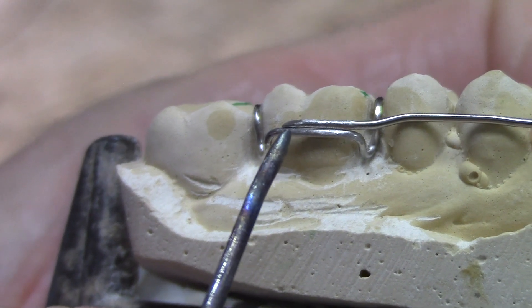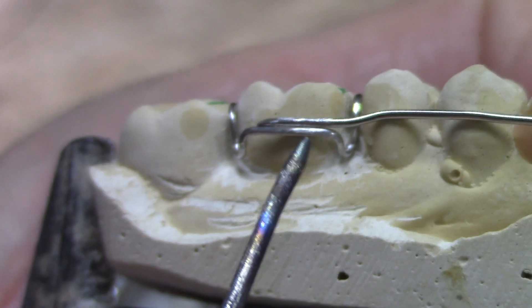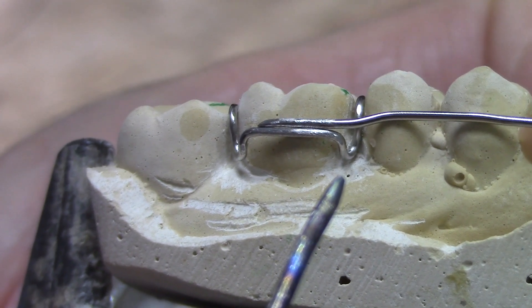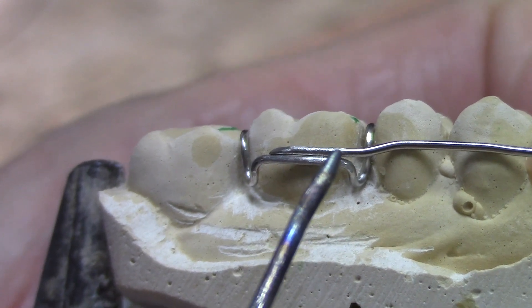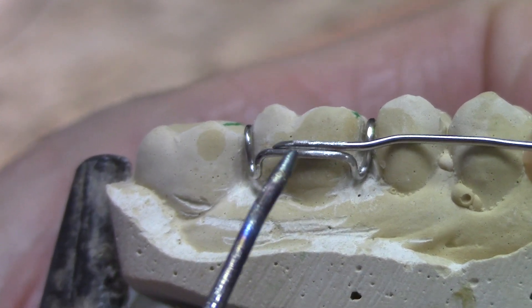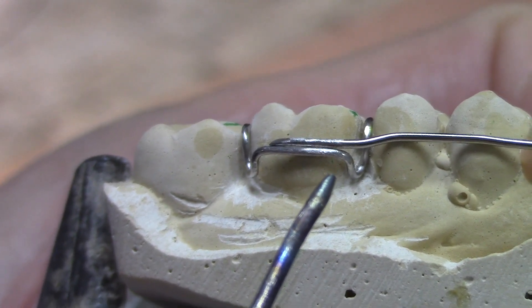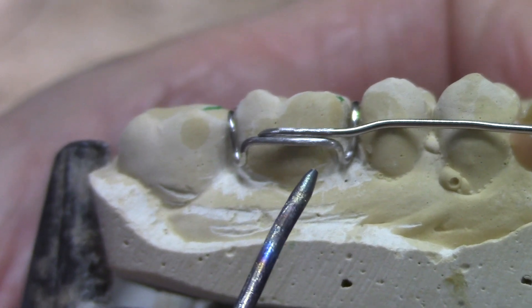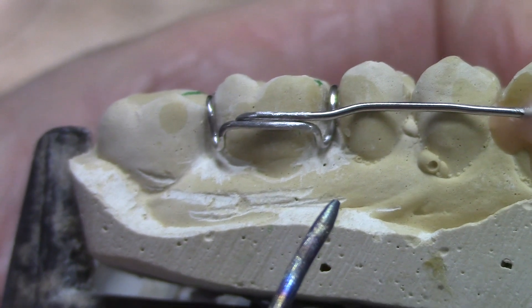You'll notice I've got the wire tapered on the end — the labial bow wire — and I've got the wires roughened up. I roughened it up so it'll have a good mechanical bond. I taper the end of the labial bow wire so that I can fully encase the wire in solder. I also have the wire laying one right on top of the other so we can have capillary action pull that wetted solder into the joint.